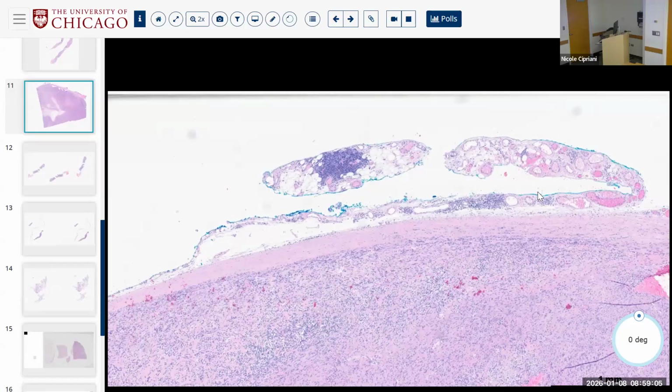So it's thought that they arise from the myogenic layers of the vasculature, rather than the myogenic liposarcomas, which arise in the fat. So those two things: MDM2, and is there a vessel? But they 100% do exist. They're just generally associated with a vessel.